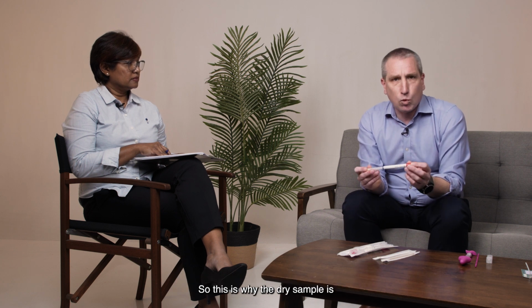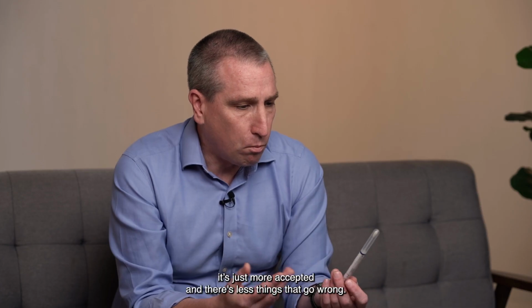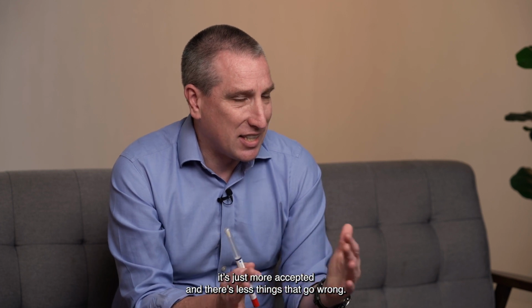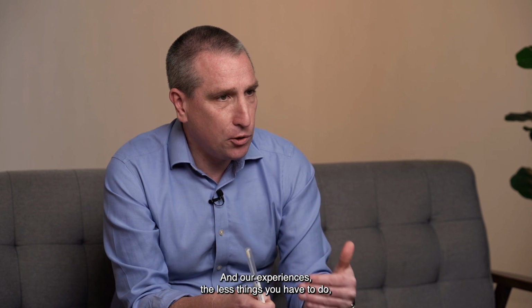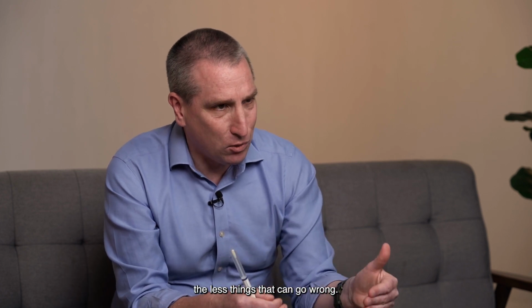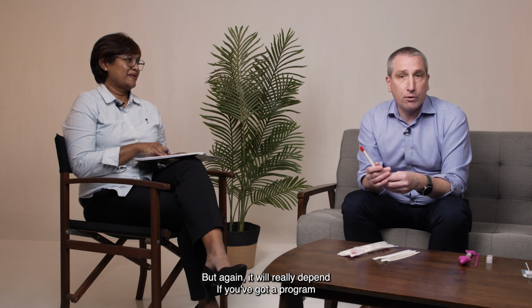And so this is why the dry sample is probably more preferred. It's easier, it's cheaper, it's just more accepted, and there's less things that go wrong. And our experience is the less things you have to do, the less things that can go wrong. And I'm incredibly lazy, and so I don't want to deal with things going wrong. So simpler is better. But again, it will really depend.